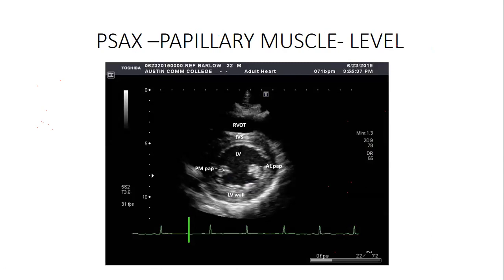Again, you move down. If you don't understand what a papillary muscle is, that is another problem. That's why I'm emphasizing and explaining what a papillary muscle is. If you tell me pass, you are passing the lecture. So this is short parasternal axis. Again, you tilt your probe. I'll keep emphasizing, this is still a practical thing which I need to show you. Just tilt your probe, you go to papillary muscle level, still in short parasternal axis.